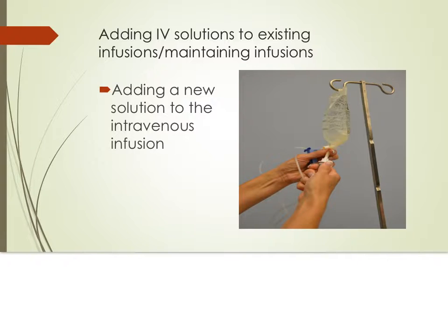Finally, dispose of the empty container after removing and destroying any labels that include the patient's name, and make sure you document the added fluid on the IV flow sheet or MAR so that I's and O's and appropriate documentation is maintained.